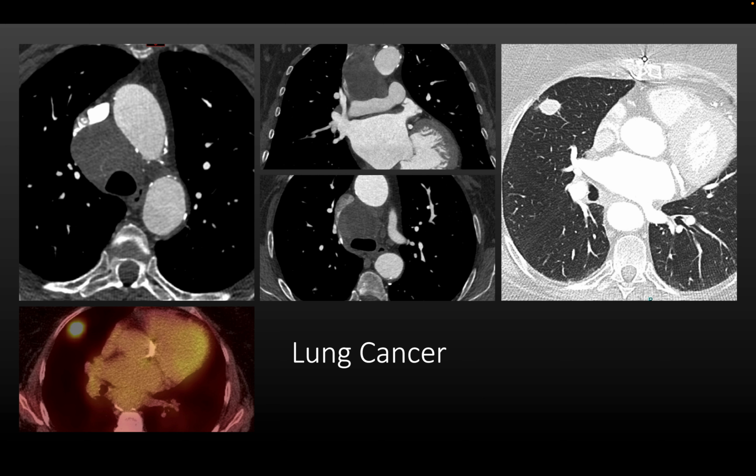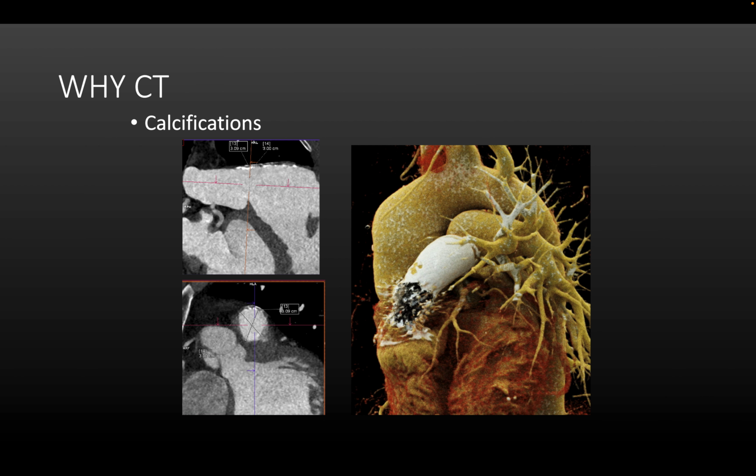And please always look at the bigger picture. Some of those patients being referred, we could see lung cancers or an extracardiac complication that might change the management. Vascular, when it comes to vascular, of course, the description of calcification before intervention, because if it's severe and circumferential during balloon dilatation or during the procedure, it might dissect the vessel.